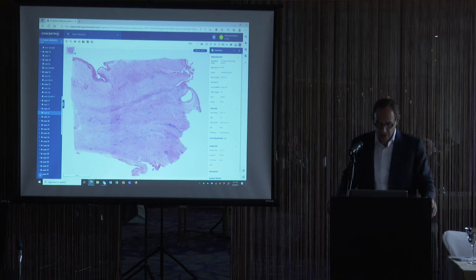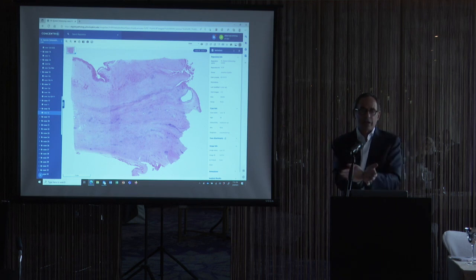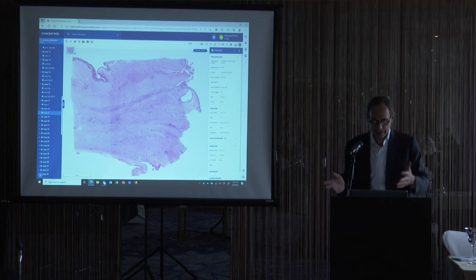So this is a hydrocele sac. A hydrocele basically is just the mesothelium that's coming down from the peritoneum that goes down around the testes, and gets filled with fluid often. And it often becomes fibrotic and thick and just chronic irritation in the hydrocele sac. And so they take out the hydrocele sac and they drain the fluid.